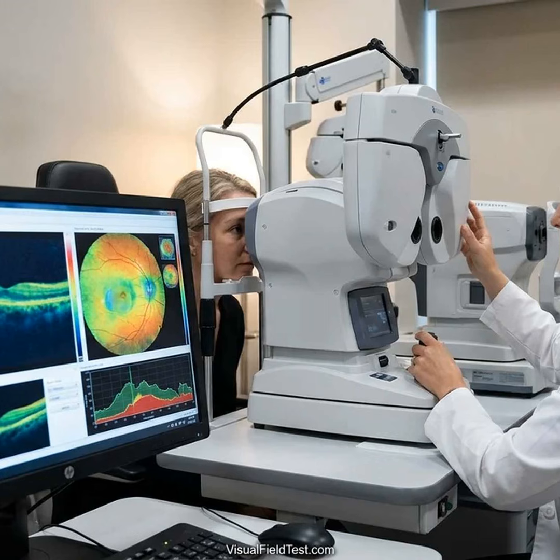Ganglion cell complex, GCC. This is the layer in the macula, central retina, that contains the cell bodies of the retinal ganglion cells, the nerves that carry vision signals to the brain. Since glaucoma kills these cells, doctors also measure the macula's GCC thickness. OCT can show if these cells and their inner synapse layer are thinning.